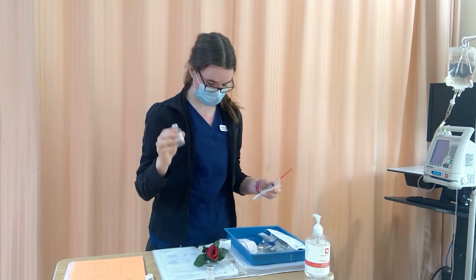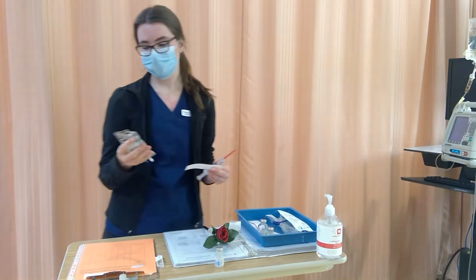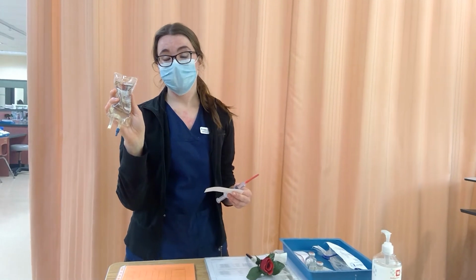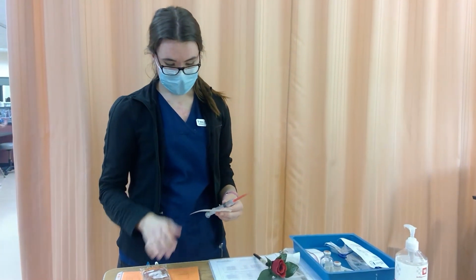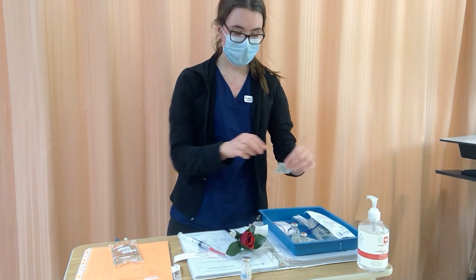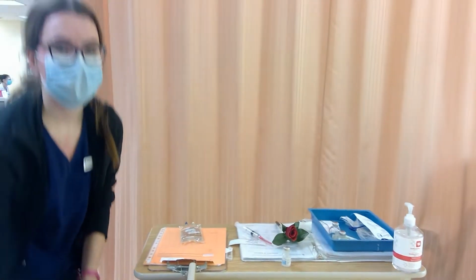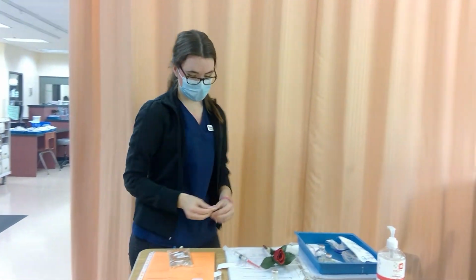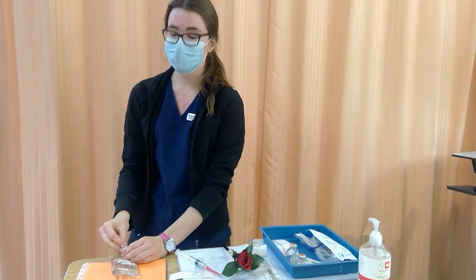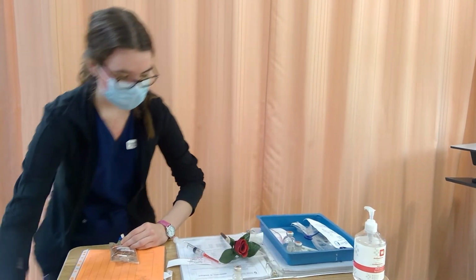Okay, so now that we have that, I'm going to select out my correct mini bag, and so here's my mini bag of 100 milliliters of normal saline. Like we said, we can insert it into there, and that way we will be more diluted, because allergic reactions with penicillin are super common. So I'm just going to clean the port here for 30 seconds, let it dry for 15.